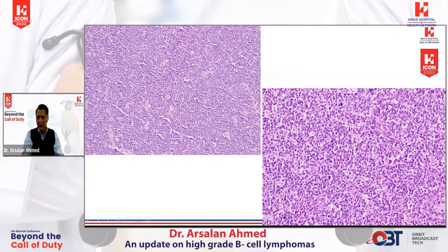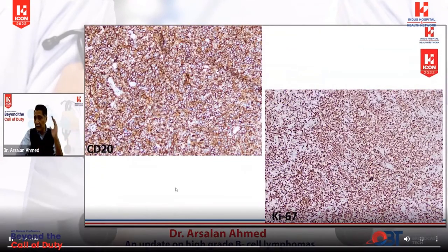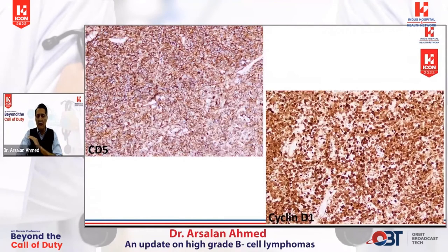They had inconspicuous nucleoli and were fairly uniform. They were CD20 positive and the Ki-67 index was very high. So again, they were looking monomorphic. The first thing I did was go ahead and do CD5 and cyclin D1: positive, very positive. So a very easy case.